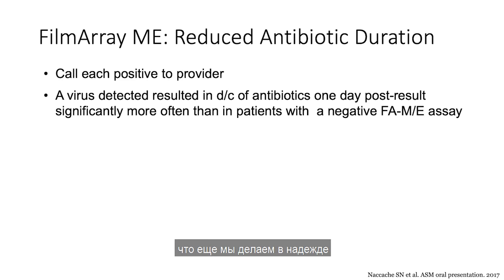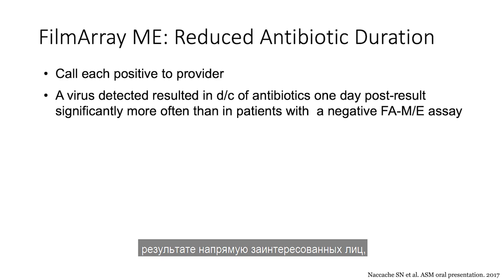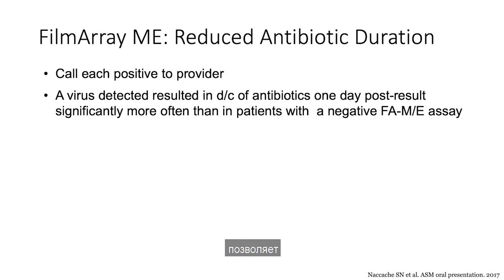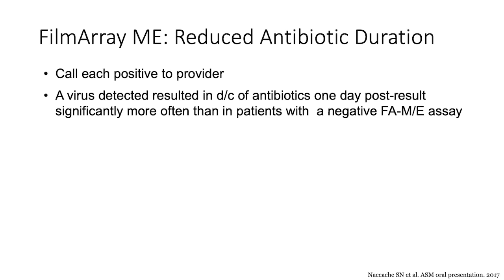Some of the things that we do to hopefully help reduce duration of antimicrobials is we call each result to the provider directly, in addition to reporting it in the electronic medical record. And what we found is that a virus being detected resulted in faster discontinuation of antibiotics, by about 1 day, compared to a patient with a negative FilmArray assay.